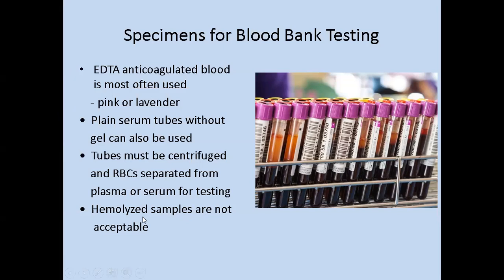Hemolyzed samples in blood bank are not acceptable. If I look over here, maybe that one's not centrifuged. I was hoping I could see one that is pink or red.